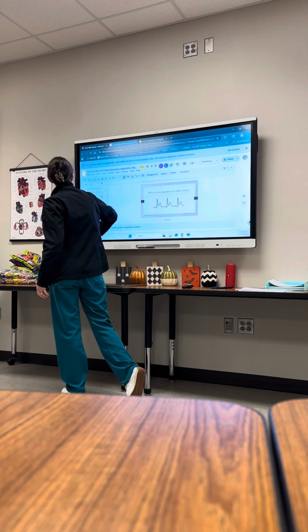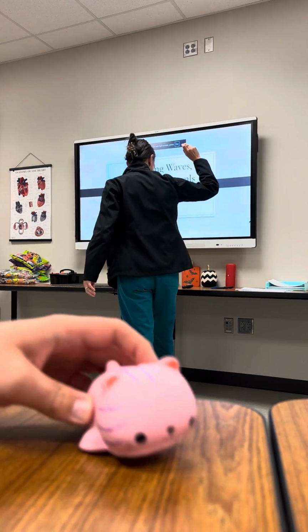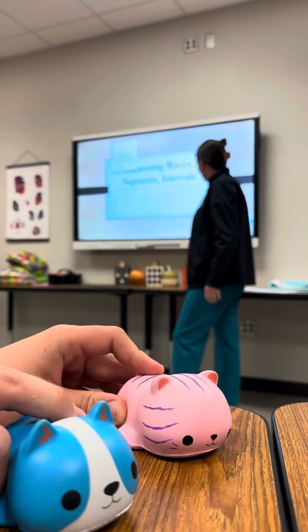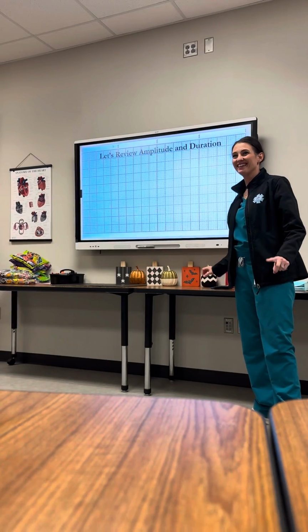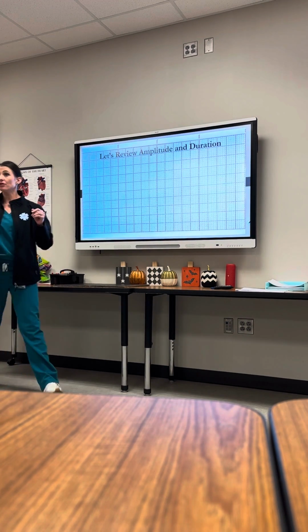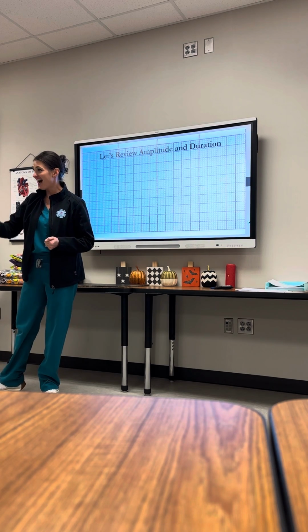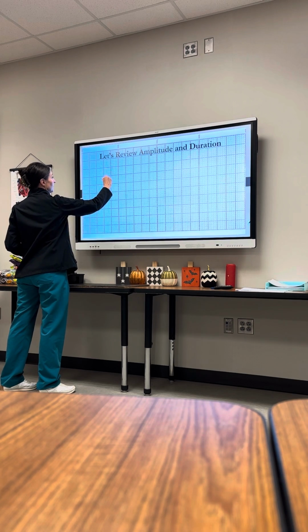Okay, let's get into this. Wave segments intervals. First thing I want to do is review amplitude and duration real quick before we get into talking about our concept. When I hear the word amplitude, I'm thinking about what axis? Y, or vertical.